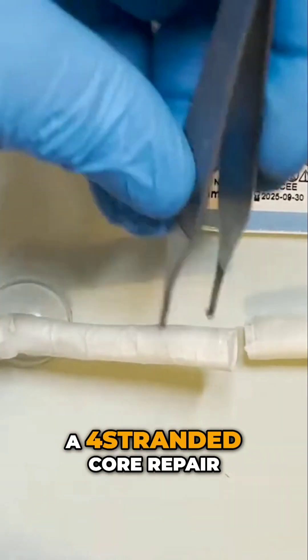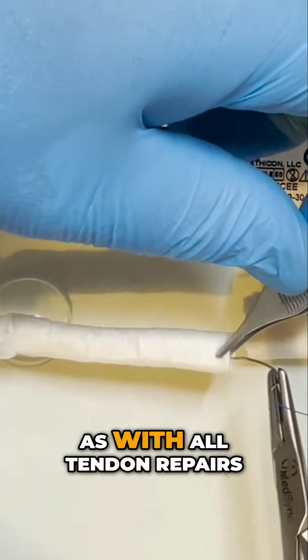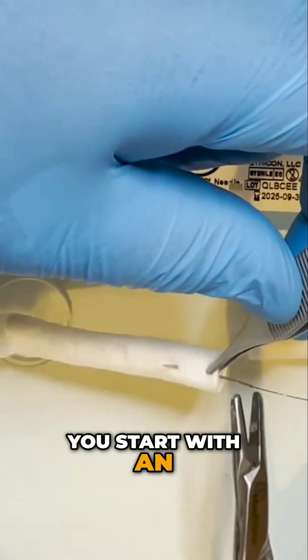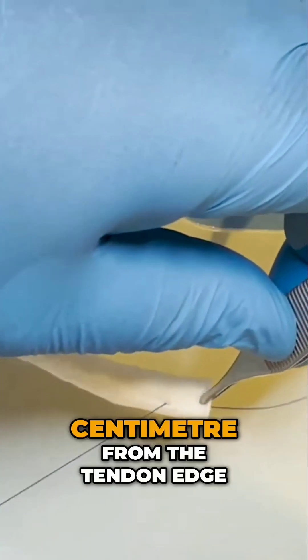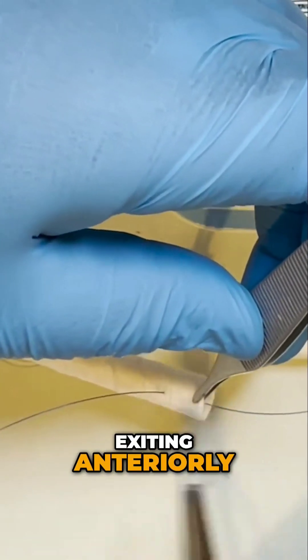The cruciate repair is a four-stranded core repair. As with all tendon repairs, you start with an axial bite through the center of the tendon substance, at least one centimeter from the tendon edge, exiting anteriorly.